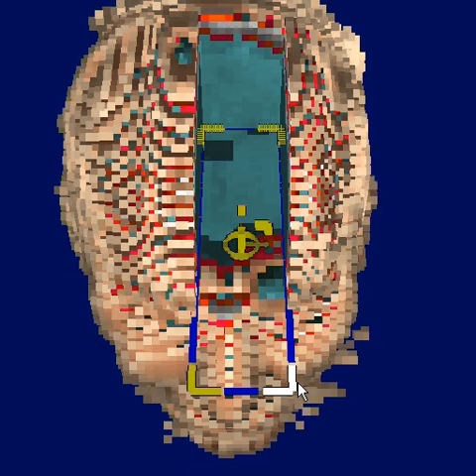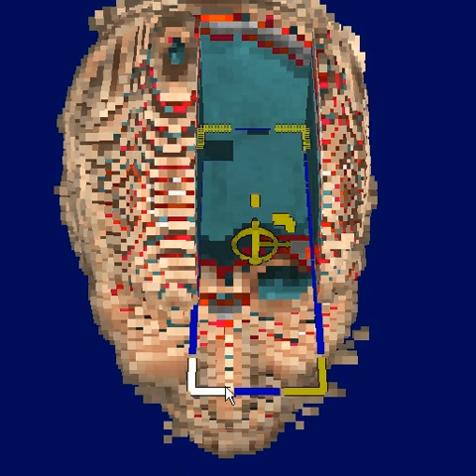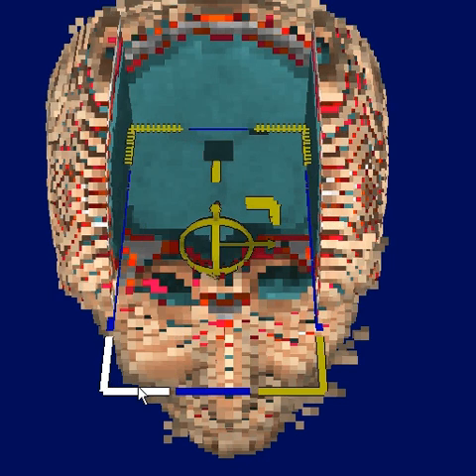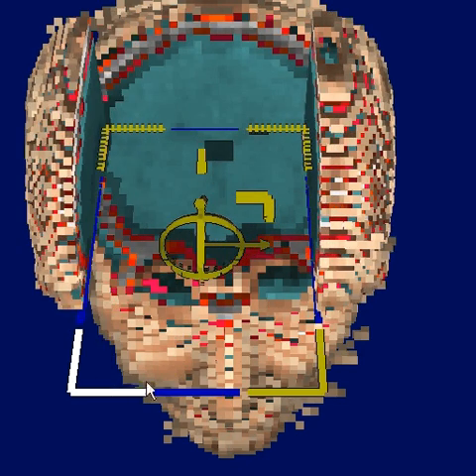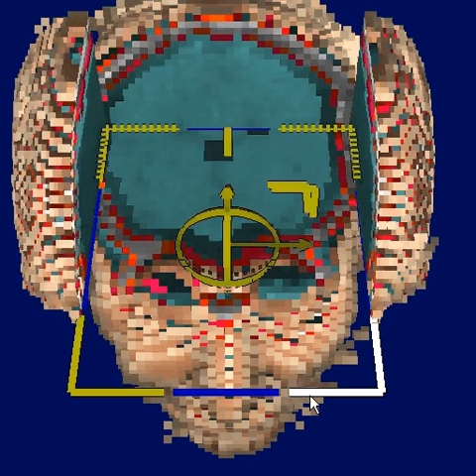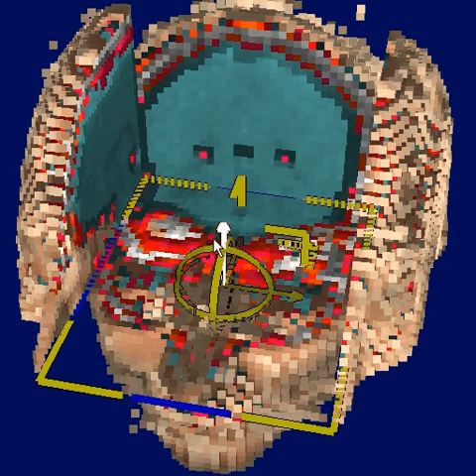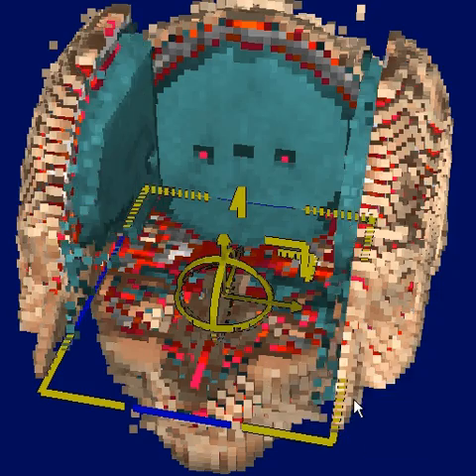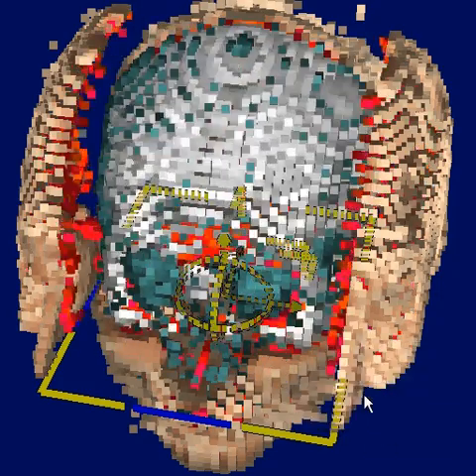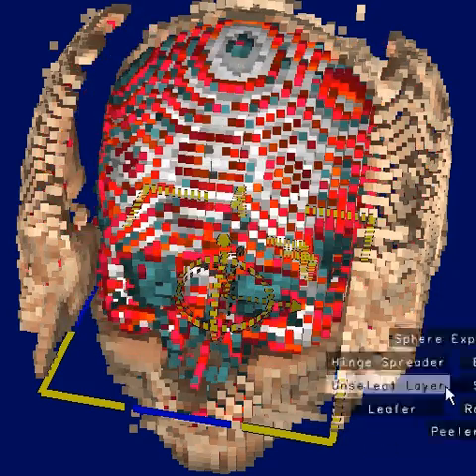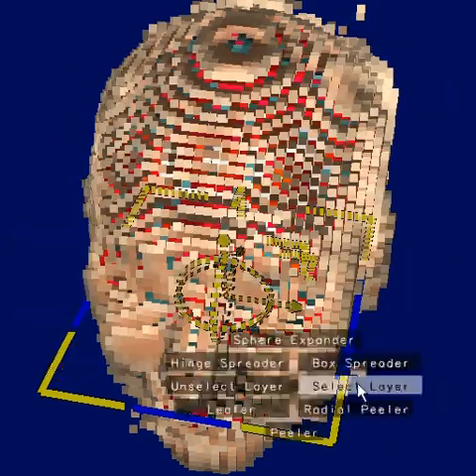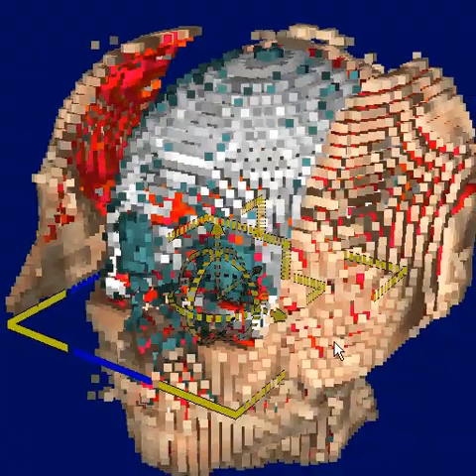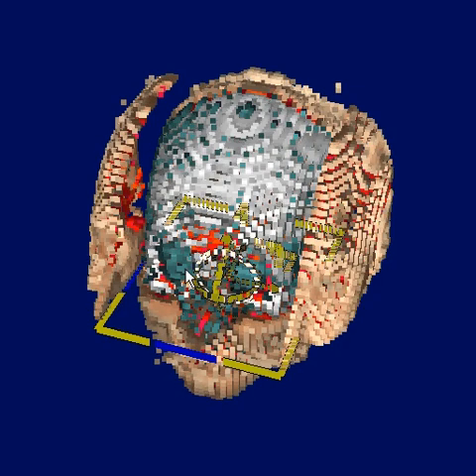We can make the box wider and see how it pushes voxels to the side. If we unselect the inner layers, they animate back into place. So we can, for example, use this tool to lift the outer tissue off the skull.